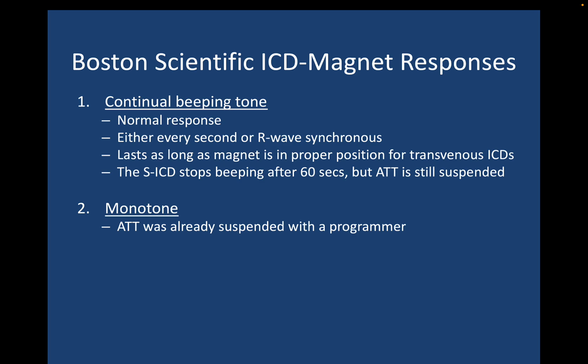The second potential response of a Boston Scientific ICD with respect to a magnet is a monotone. What this means is if you put a magnet on the Boston Scientific ICD, instead of that beeping tone, you will hear a continual tone, like a beep. What this indicates is that somebody has already turned off the anti-tachy therapy of that Boston Scientific ICD.